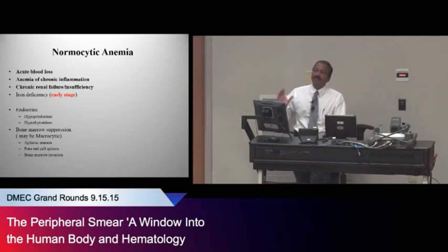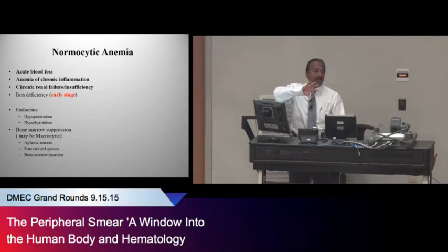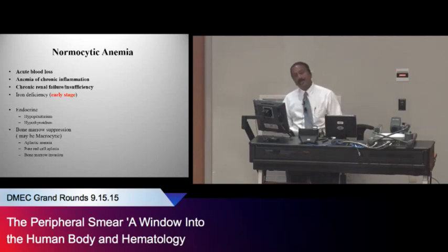Remember, while it's very useful to have this classification based on the size, in the real world, most patients have a mixed picture. So they won't fall wonderfully into categories. If you have an MCV of 72, that's fantastic, but they won't give you an MCV of 72. They'll actually have an MCV of 86 and have a little iron deficiency, and you still have to supplement with iron. And they'll probably have a little bit of something else, so they'll show a mixed picture. Keep that in mind.